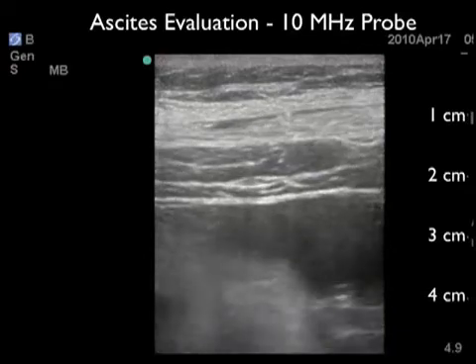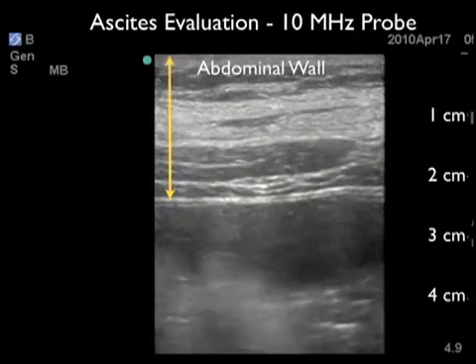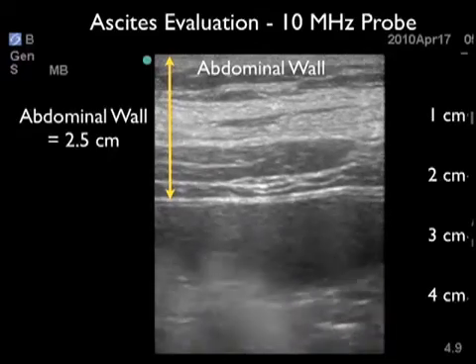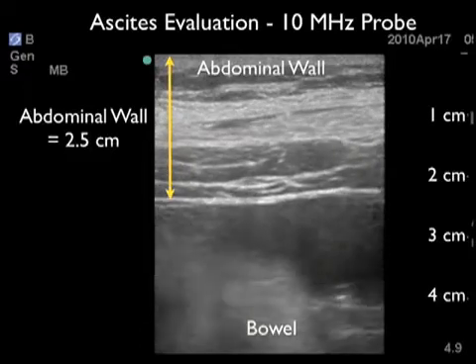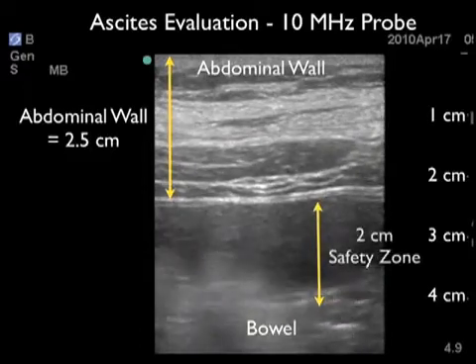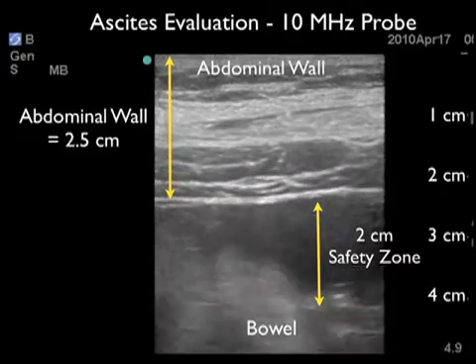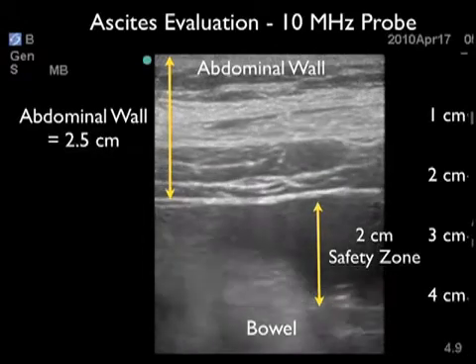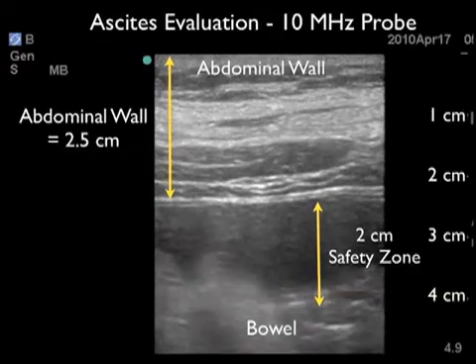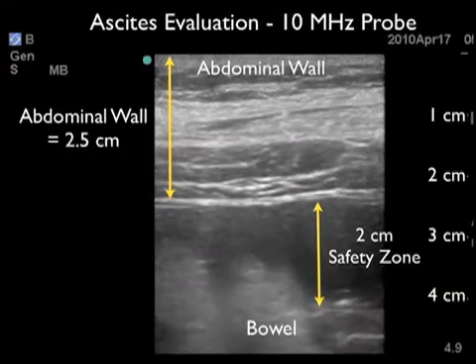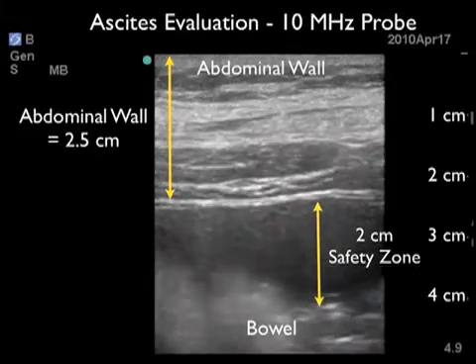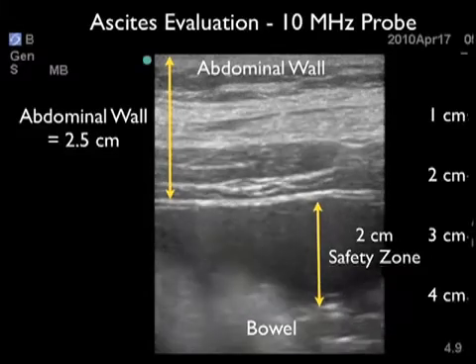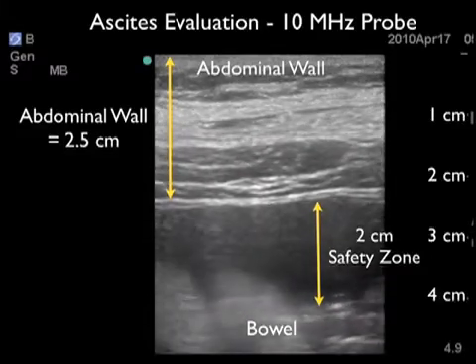Another benefit of using the higher frequency probe prior to paracentesis is to investigate the depth of the abdominal wall, as a thick abdominal wall can frustrate attempts at the procedure. Here we see the depth of the abdominal wall measuring 2.5 centimeters anteriorly. We can see the peritoneal lining just deep to the abdominal wall, ascites as the dark fluid collection just deep to the peritoneal lining, and gut sliding deep within the ascites. Note the 2 centimeter safety zone for needle placement, but we would need a needle longer than 2.5 centimeters just to get through the abdominal wall to obtain fluid.